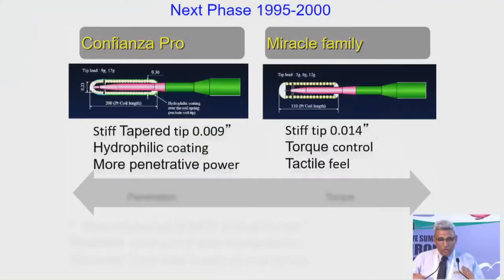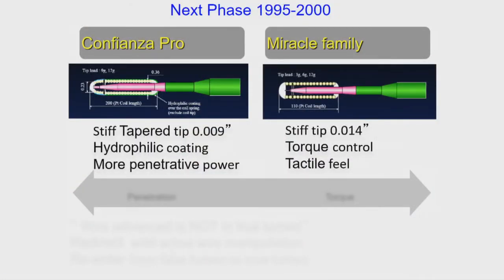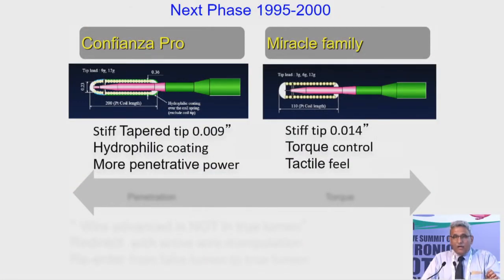So choosing a wire is the first step after getting a good bilateral access, understanding the CTO, understanding what we are going to do, and making sure that we have a good control angiogram. We have to now understand if we are going antegrade, are we going to do an antegrade wire escalation? Are we planning to do an antegrade dissection re-entry? Or are we planning to go retrograde?